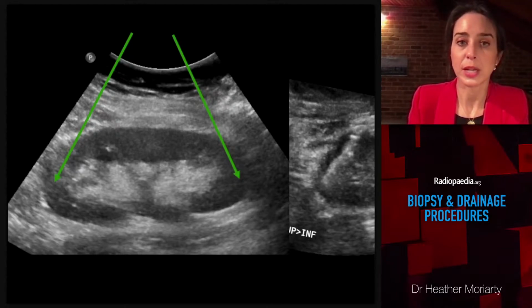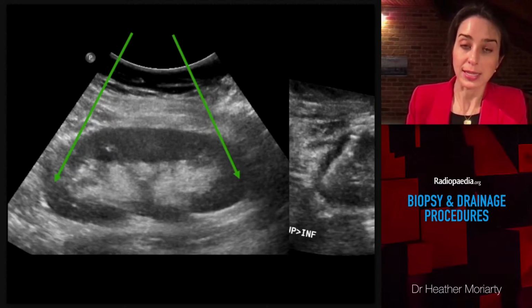It's important to manage hypertension prior to renal biopsy, particularly in the renal patient, because there is data to show an increased risk of bleeding, actually up to 10 times the risk of bleeding when the blood pressure was above 140/90 in one series.